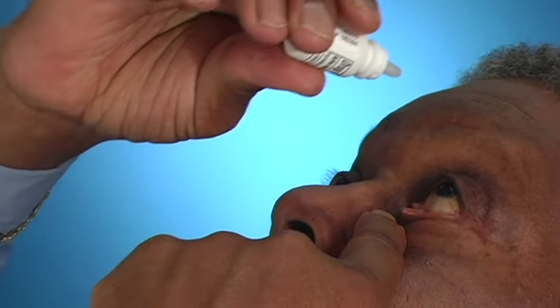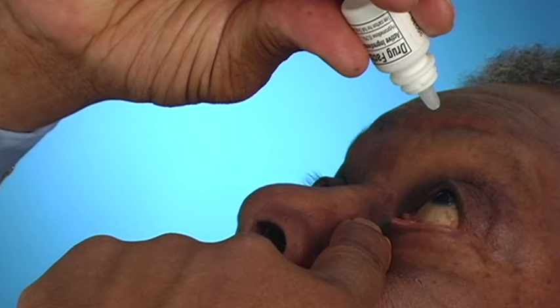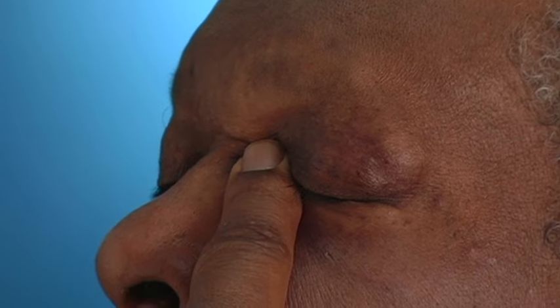With your other hand, hold the dropper tip directly over this eyelid pocket. Look up and let the eye drop fall into the pocket without touching the bottle to your eye or eyelid, to prevent contamination of the bottle.